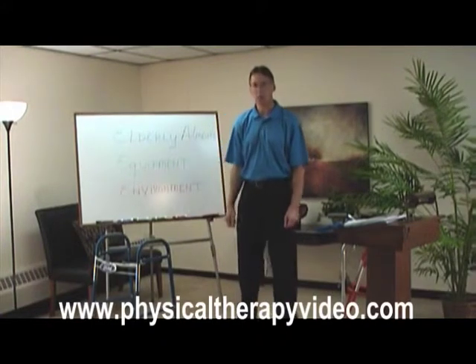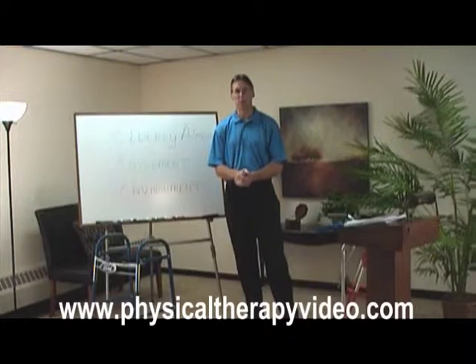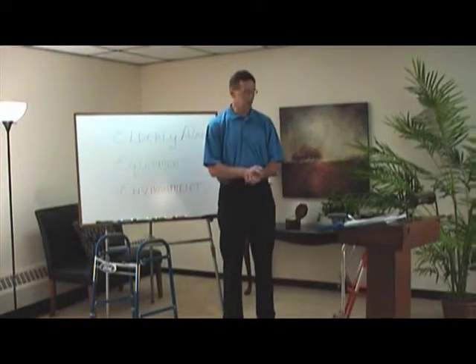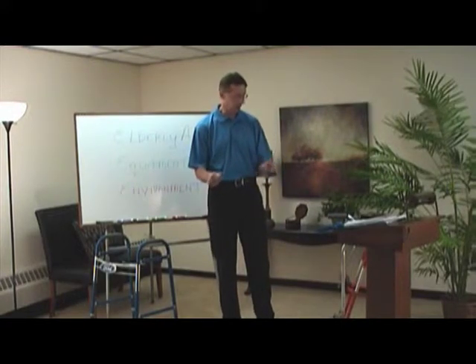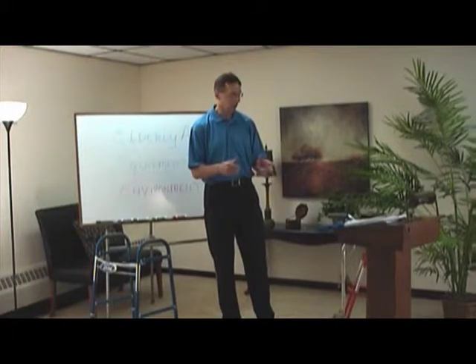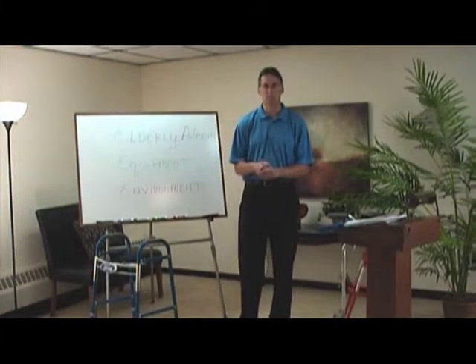Now we'll talk about equipment that might help the person who is at risk for falling within their home. The first thing, again, as we mentioned earlier, is that for many people it can be as simple as using some type of gait aid. And by gait aid, we mean walker, cane, hemi walker, or quad cane. So let's first talk about at what height these should be set.